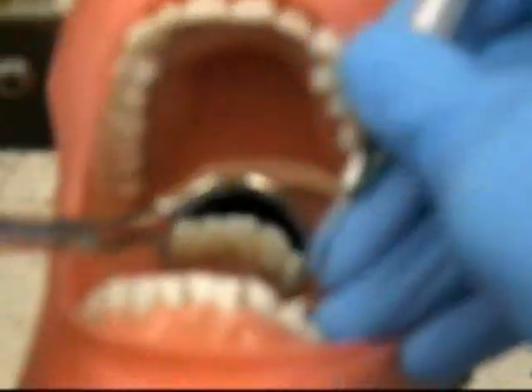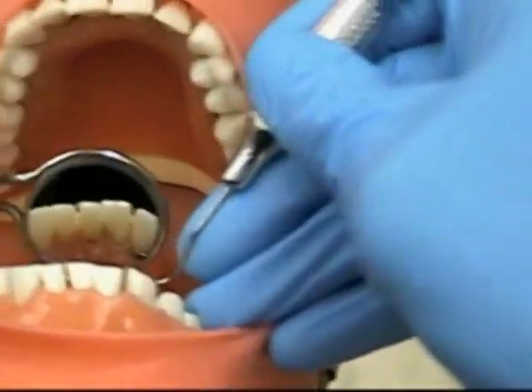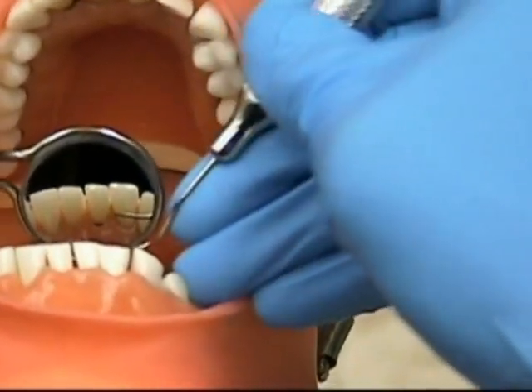Okay. Lingual surfaces towards you. Use indirect vision. Rock the wrist and roll interproximally.